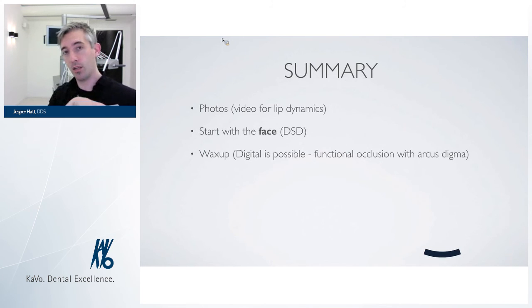Or we can transfer our manually constructed WAXUP, scan that, and put it on top of our intraoral scan of the patient. So we have the ability to switch around the different data we have from analog to digital. We can have a digital model and just mill out a provisional or something that we can put on top of the teeth for the patient to see ahead of time.